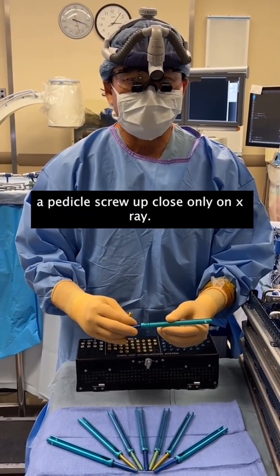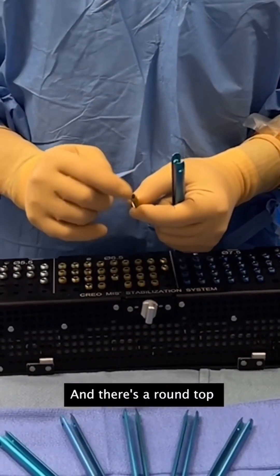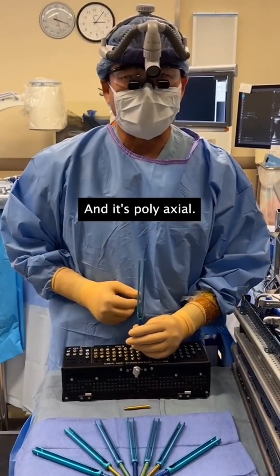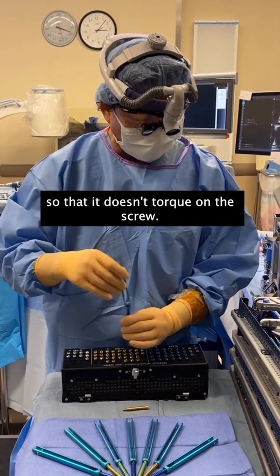I bet you've never seen a pedicle screw up close, only on x-ray. So here's what they look like. Here's the shank of the screw right here, and there's a round top where the head and the extension sleeve goes on. It's polyaxial — that means it can roll around. It allows you to pass the rod, and you need that flexibility so that it doesn't torque on the screw.